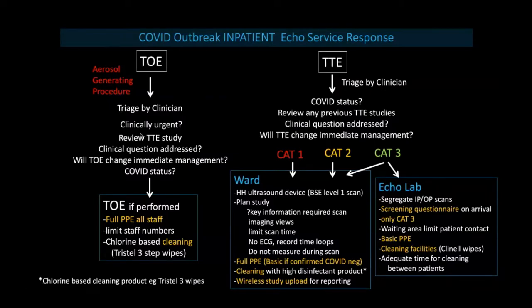The patient's coughing, gagging, and we're suctioning. So we have to ensure there's a good reason to do the investigation. And so the first question is, are there other alternatives that we can use? Is there previous imaging on the patient? Do we have any transthoracics that have been done recently? Is perhaps another alternative imaging modality possible, like CT for LA appendage thrombus?